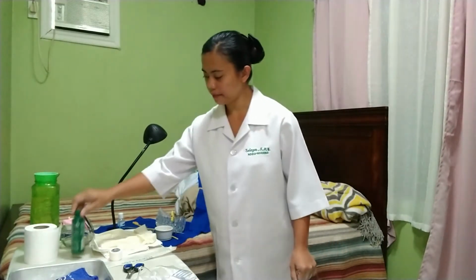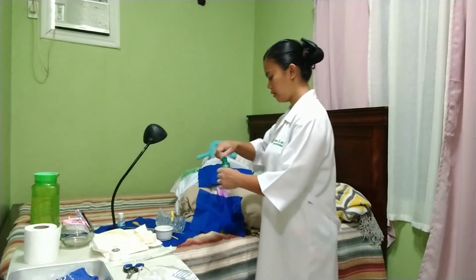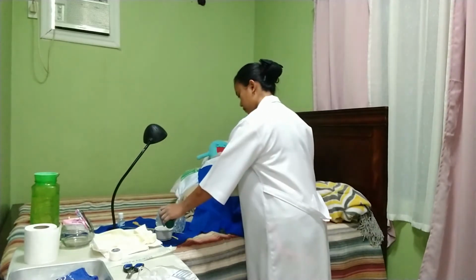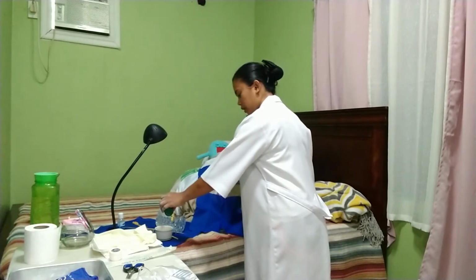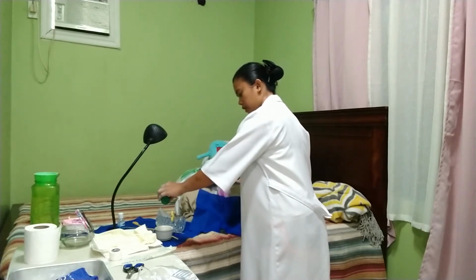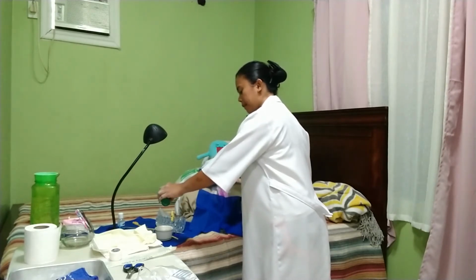Next is to apply betadine solution. So just let it drop and not too close to avoid contaminating the area.